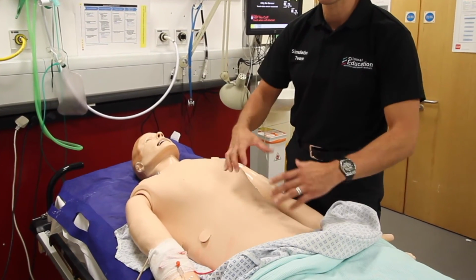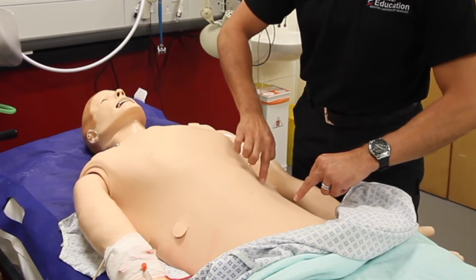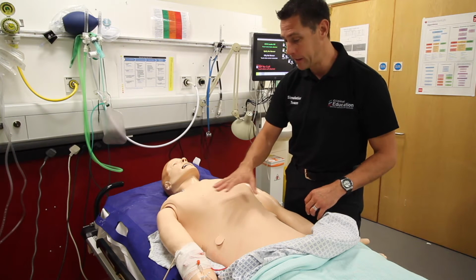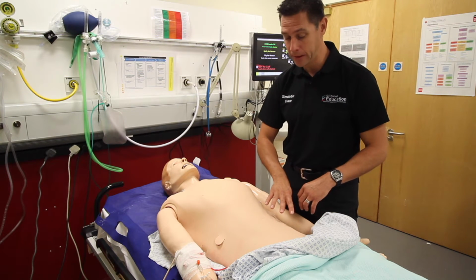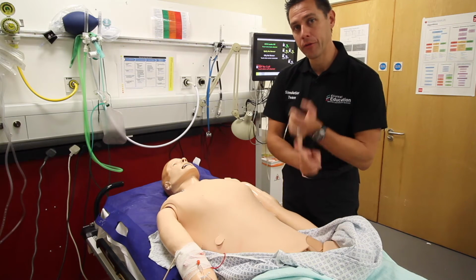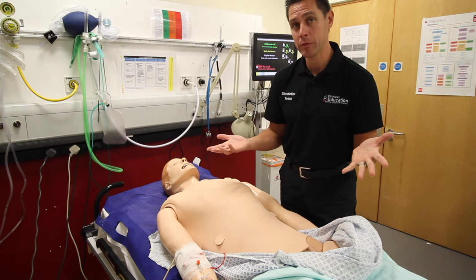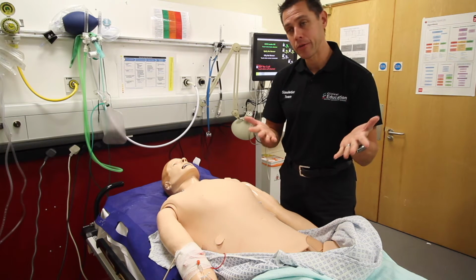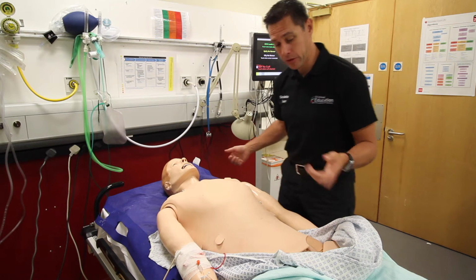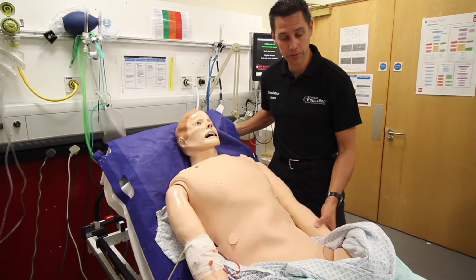So if you are interested in listening for bowel sounds, then you'll find that the speakers are in the 4 quadrants. So you'll find a speaker roughly about these places here around his umbilicus. And so you can go ahead and listen with the stethoscope, and you might get some different bowel sounds on there. As we're talking about other functions there, he's fully catheterizable, so we can put a catheter into him. He may well have a catheter in as part of your scenario, but as I've already said, we are encouraging you to do things that you would do in real time. So if you need to do a catheter, then we expect you to get a catheter trolley and prep it properly and talk him through the process.